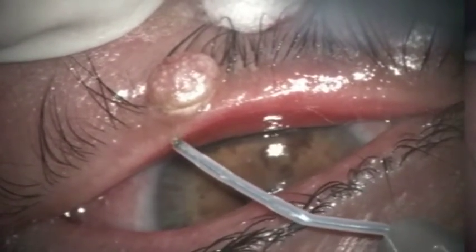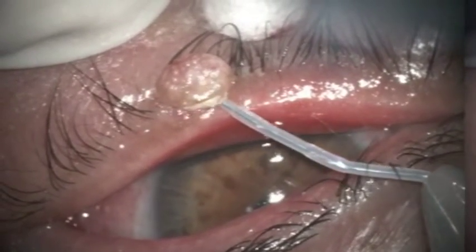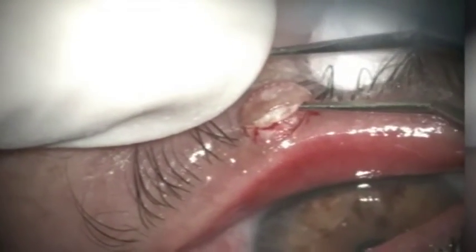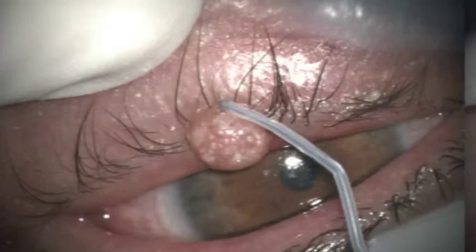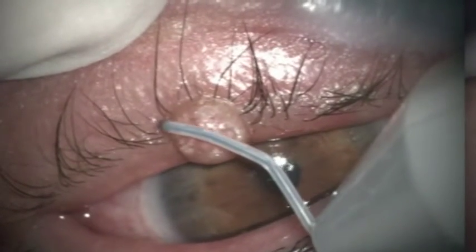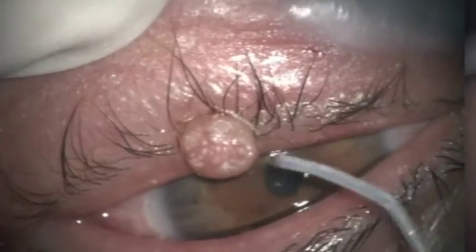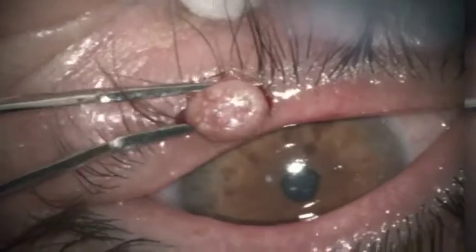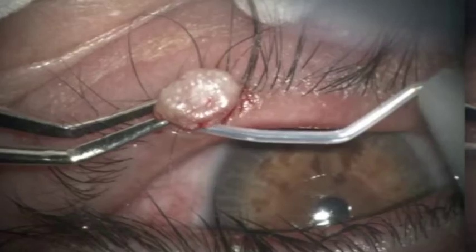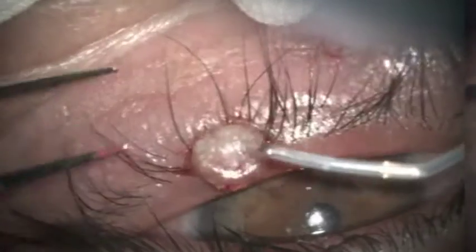Making incision at the base of a non-pedunculated lesion — I do not know what this lesion is, so I have to be very careful and try to remove all of it. Working with a 100 micron Fugo blade tip until I can grasp the whole nodule and cut it from underneath.